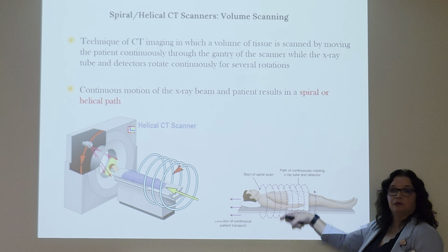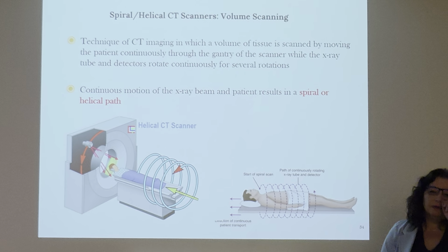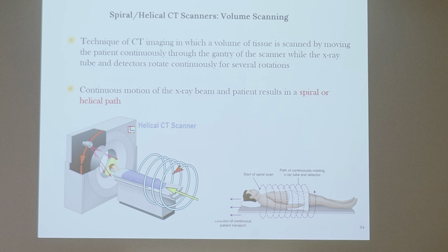Okay? Yes. And for the gantry, for centering, it would be like a regular X-ray, how we do it in the rooms, like T7 for chest. Yeah. Exactly. It's specific protocols. It's not going to be like T7, but it's going to be specific protocols.